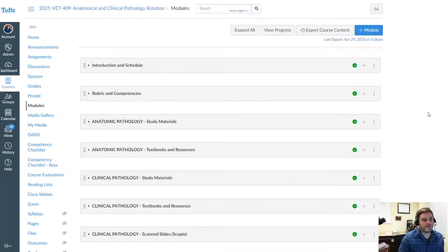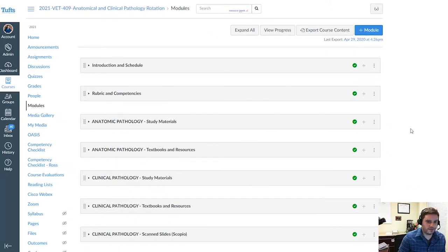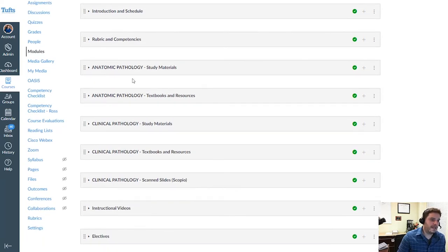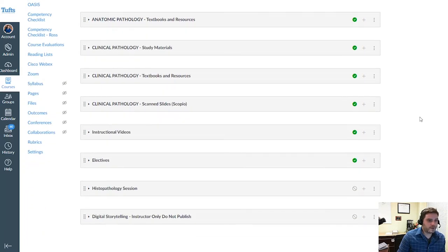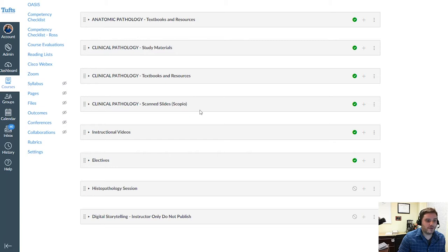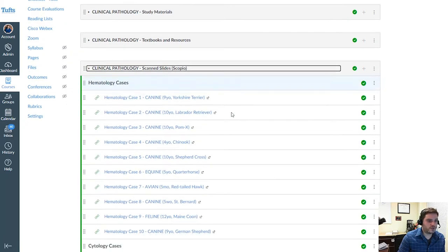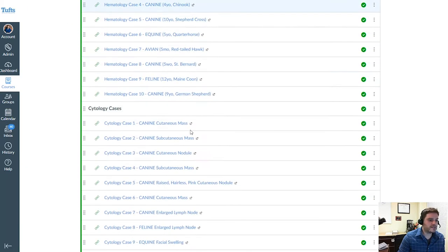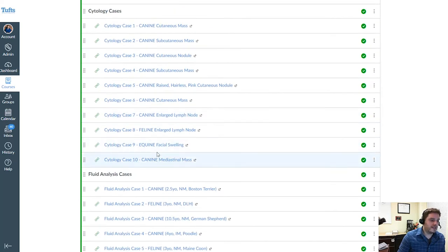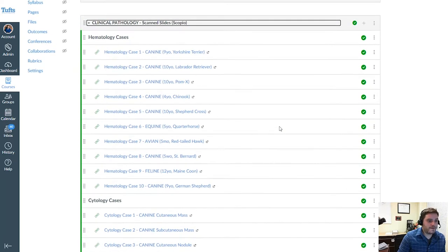This is a typical Canvas website where we keep all of the clinical rotations materials — in this case, the anatomic pathology and clinical pathology rotation. All of the slides that the students have reviewed using the microscopes in class are here available for them to review also in a digital format. By clicking on this module, they have access to the hematology cases, the cytology cases, and the fluid analysis cases that they have reviewed in class.